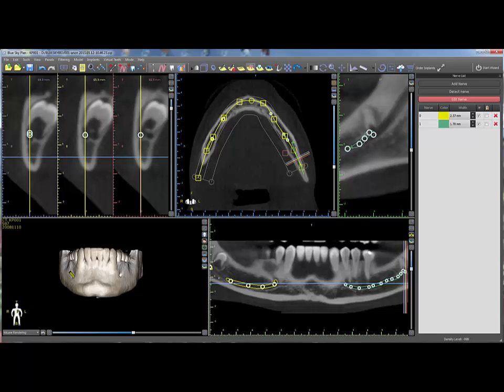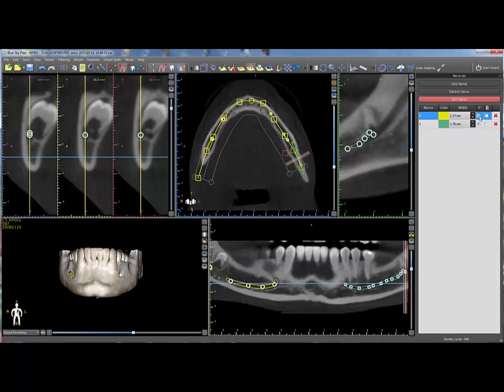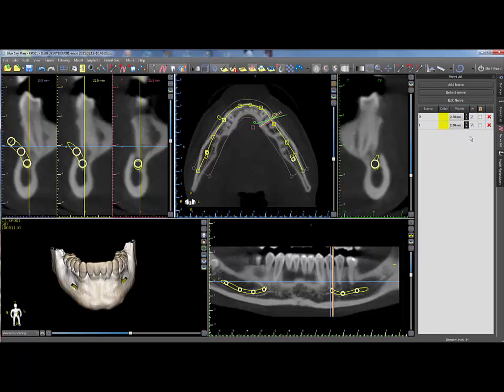A nerve can be hidden by unchecking the box in the nerve visibility column. To prevent changes to the nerve, click the lock check box — the control points will disappear, thus preventing its movement. The nerve can be deleted by clicking on the red X in the rightmost column.